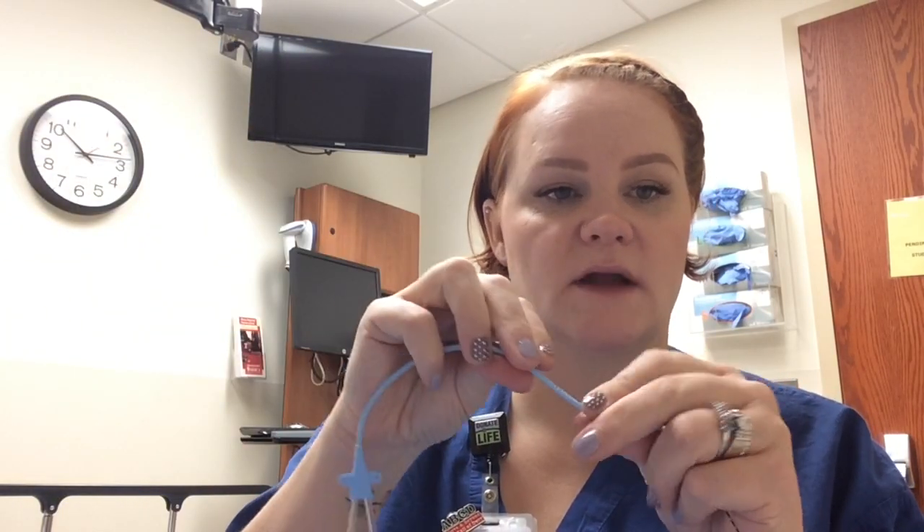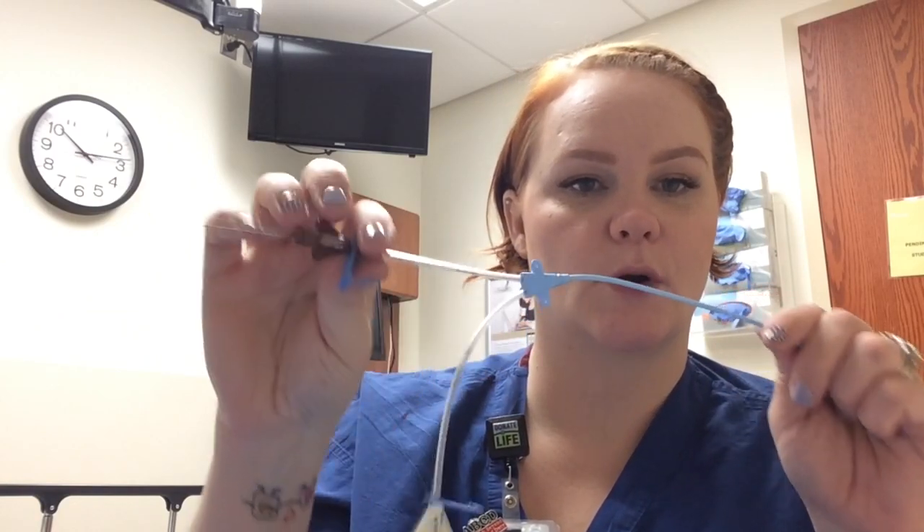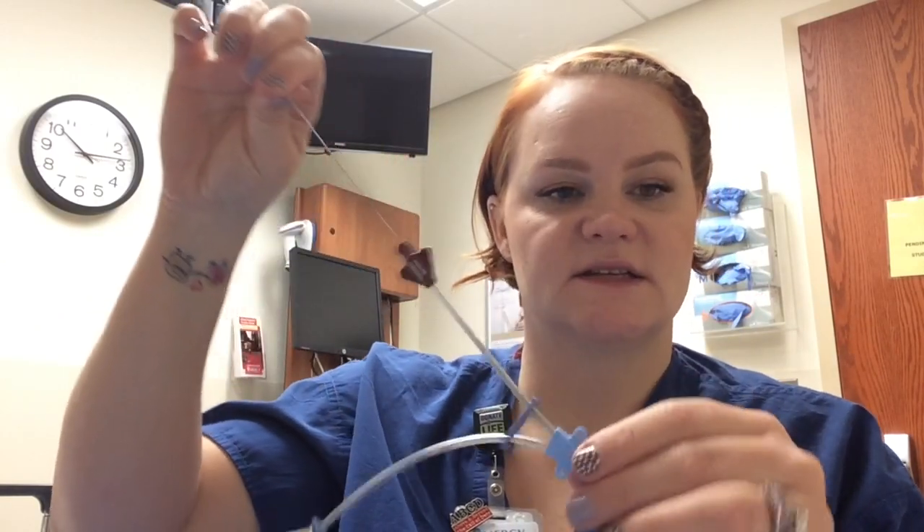Once the wire is located where they're comfortable with, they will take the device off and then also take the needle off — so the wire is what's left in the patient. They will place an expanding needle onto the patient just like that, poking it through the skin to make sure the hole is big enough, then remove it. The next process is to go ahead and attach the central line itself. They will guide the central line over the wire, and the wire will come out the brown port. Once this is all the way down into the patient's skin, the central line is technically placed. They'll go ahead and suture it down and flush it, making sure they have good return.